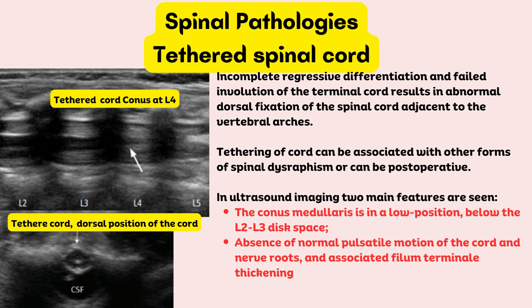Now let's look at some common spinal pathologies. Cord tethering is an incomplete regressive differentiation and failed involution of the terminal cord, resulting in abnormal dorsal fixation of the spinal cord adjacent to the vertebral arches. Tethering of the cord can be associated with other forms of spinal dysraphism or can be postoperative. On ultrasound imaging, two main features are seen: the conus medullaris is in a low position below the L2-L3 disc space, with absence of normal pulsatile motion of the cord and nerve roots, and associated filum terminale thickening.